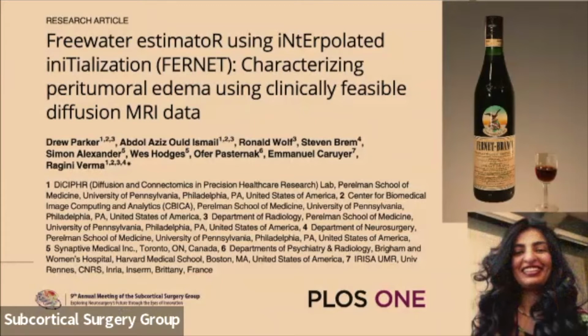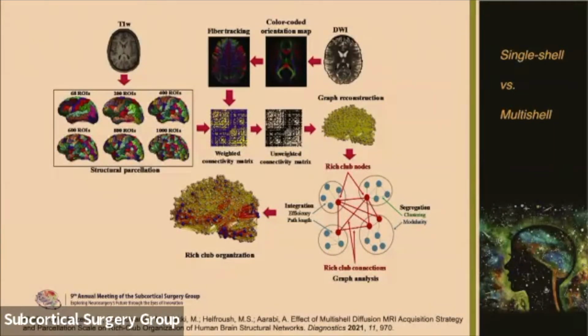And what the name indicates is that this estimator takes us from what we all know, in multi-shell MRI acquisitions. If you have a multi-shell, B value of 2000, 64 directions, fiber tracking can be quite easy, and you can achieve a very good estimation of the water. However, using in the clinic single shell MRI is what we wanted.